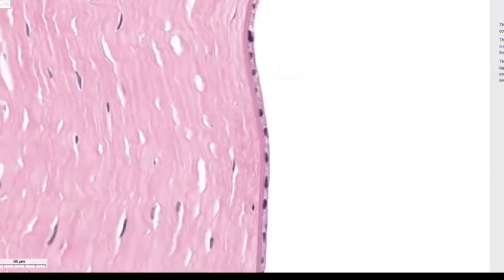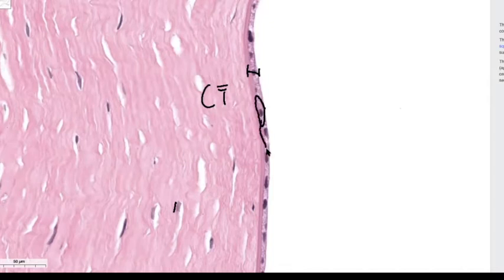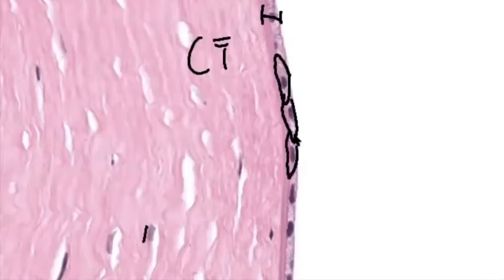So in this picture, here is the epithelial lining. Here, this is the connective tissue underneath it. Here are the scattered cells and collagen. But this is the back of your eyeball. These are the nuclei of cells. They'd all look something like this, like if we were able to see the cell membranes.